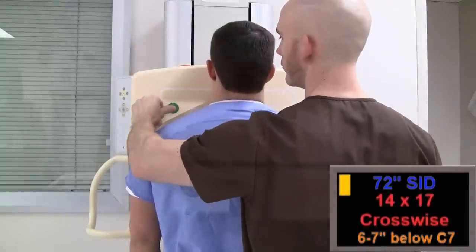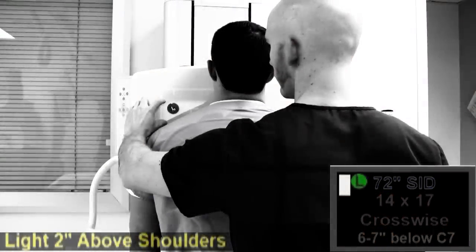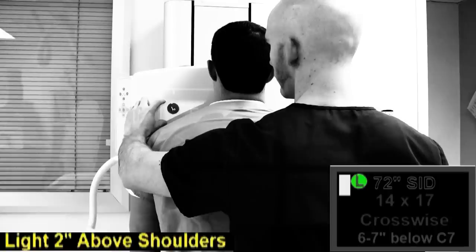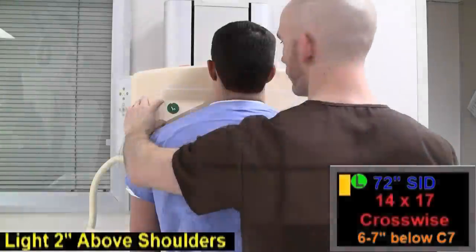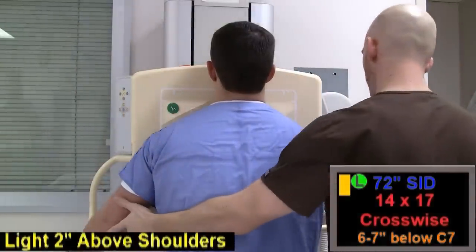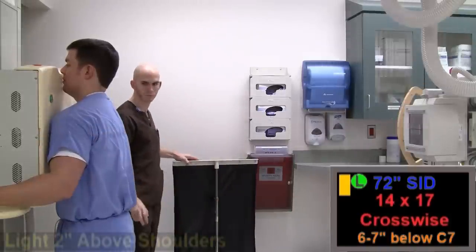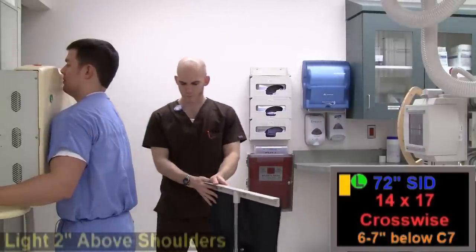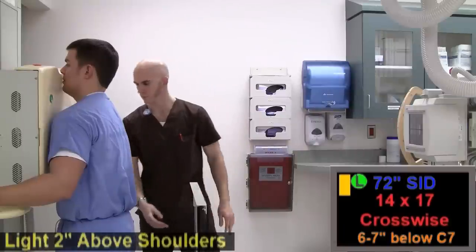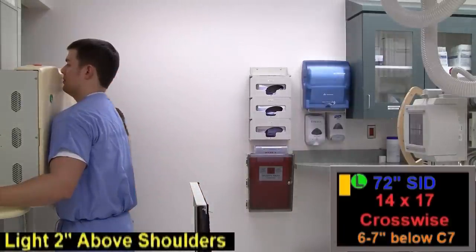Ensure two inches of light above the shoulders. Place the left marker on the left side of the patient. If the patient is unable to stand independently, have them hold the handlebars on the wall bucky. Place an adjustable shield around the patient's waist or place a mobile shield behind the patient. Ensure no rotation of the thorax.